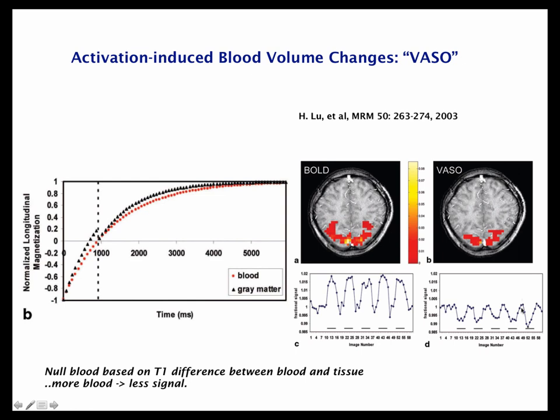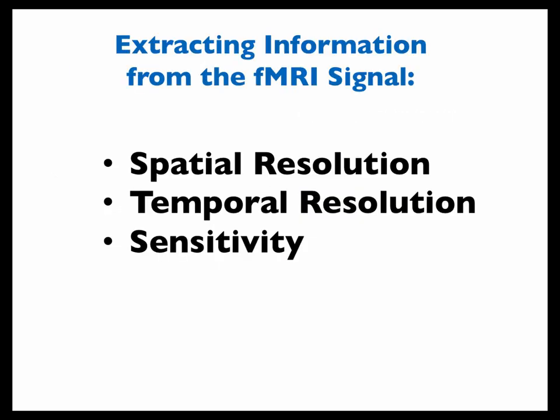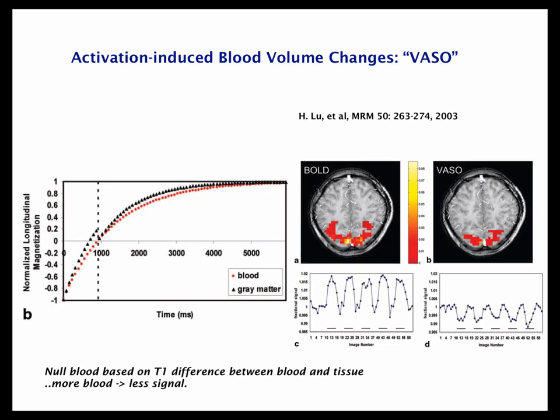And the contrast to noise is probably a little bit less than BOLD, but I would say this: if you really care about columnar or layer-dependent activity, as I showed in the results in the previous lecture, I would say that the specificity is at least better than perfusion in terms of looking at capillary blood volume changes. It turns out most of the interesting blood volume changes, if you look close enough, at least in my opinion, seem to change at the level of capillaries.